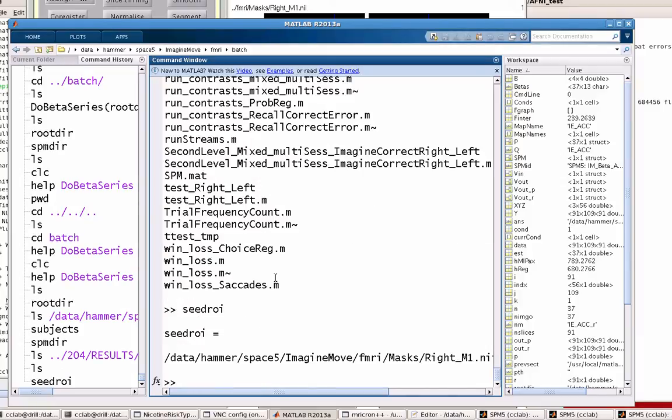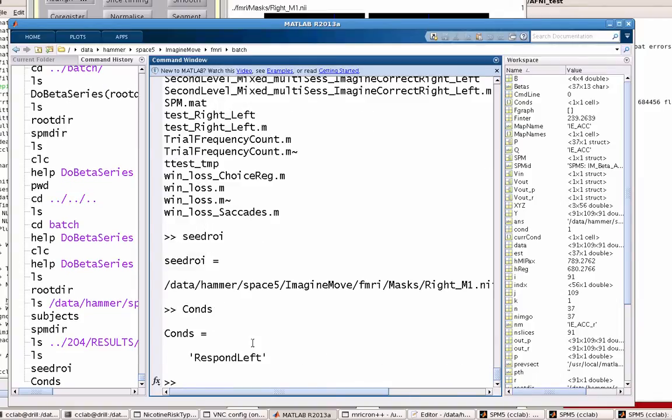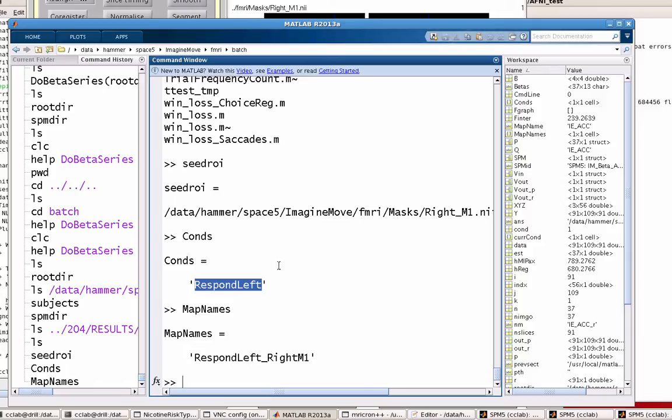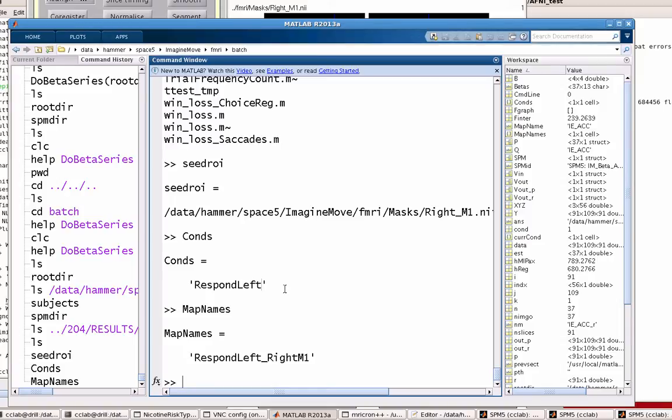SeedROI points towards where my mask is located. And then cons and map names just say what is the name of the regressor? Remember, the way that this is set up assumes that you have every instance of this regressor labeled as the regressor, then an underscore, and then the occurrence or the trial number. So in this case, there would be respond_left_1, respond_left_2, all the way up until respond_left_29. And then map names is the output. It's going to generate an R map and also a Z map that's been normalized.